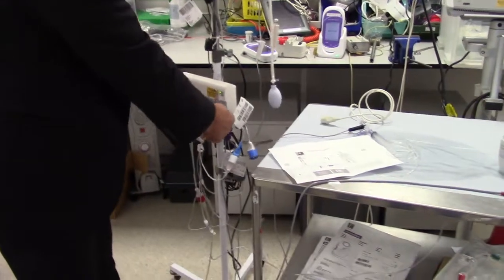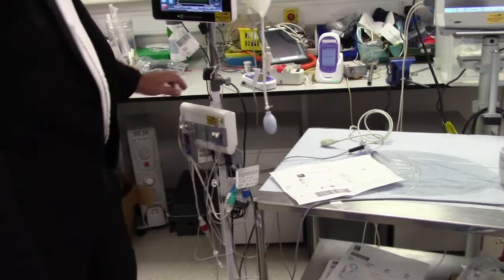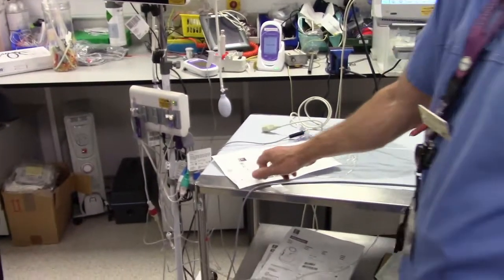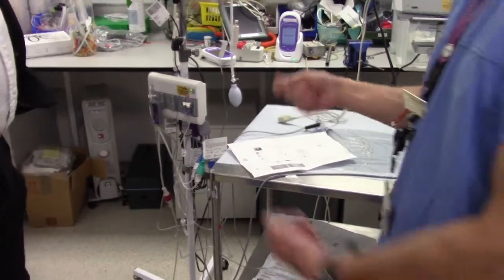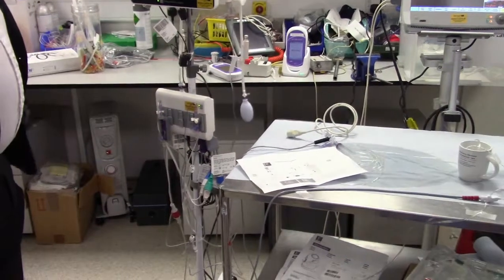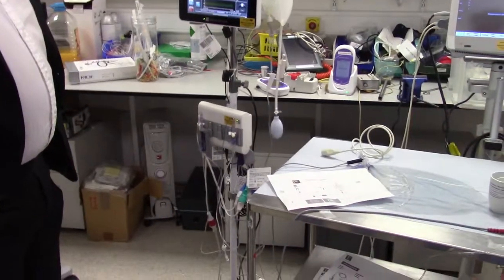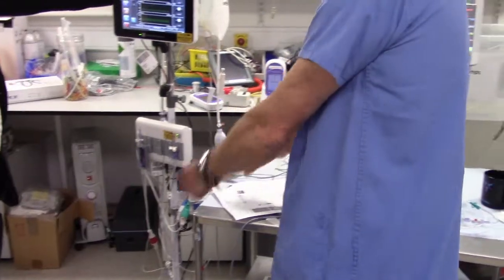Yeah, that's important because it's part of the cardiac output measurement. But if you look at that diagram, it's not clear as far as I'm concerned what needs to be connected where. That's the issue. It's easy because they're all the same sort of connectors, so you can start mixing them up. It's a pretty poor diagram, and it doesn't show the monitor on it. So you end up going, oh, where do I connect that to? That seems to fit on there, I'll just plug it in there.